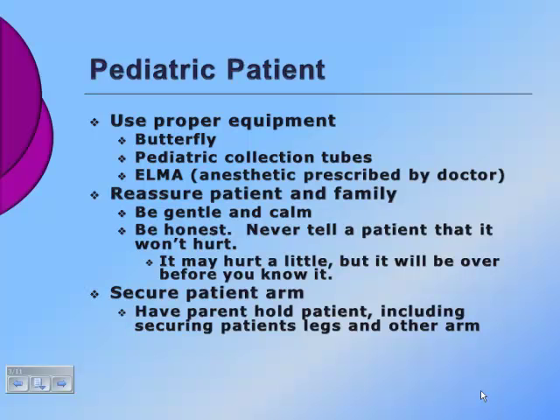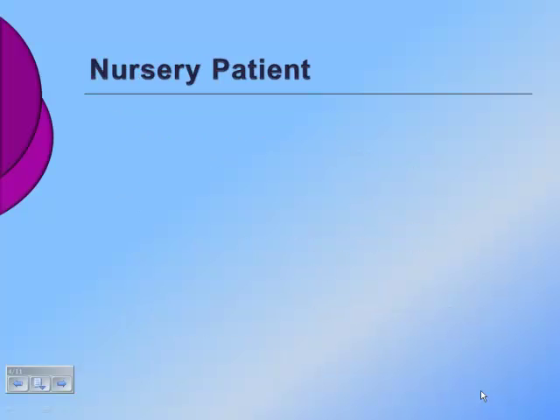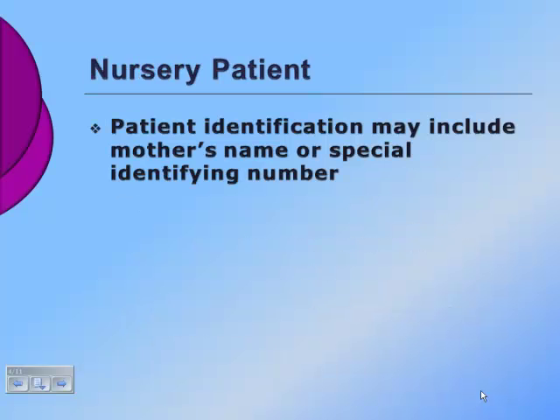In particularly small or combative patients, having a second phlebotomist or another person, nurse or other staff, holding the patient's arm securely while you're drawing it can help a lot. I've seen it take 4 full-grown adults to draw a 2-year-old, and it was all they could do to hold her still.